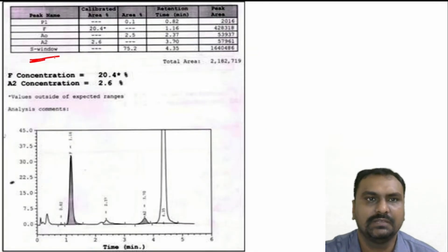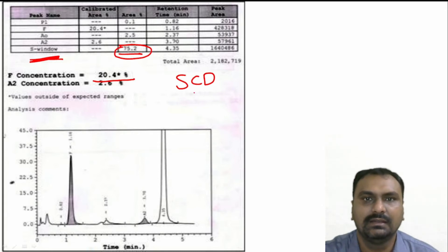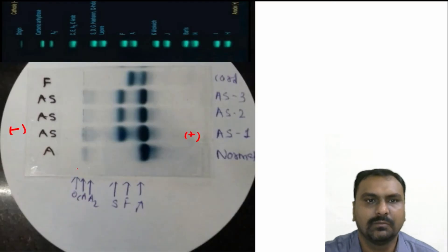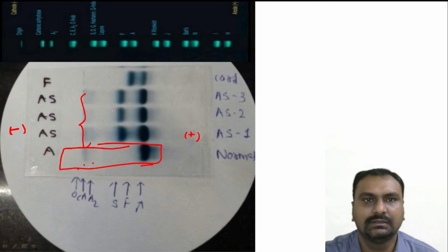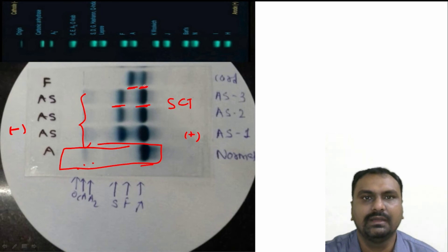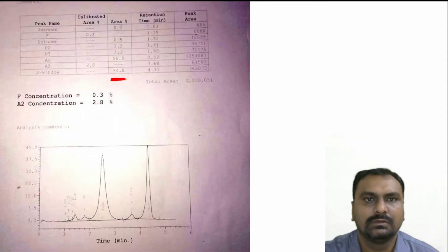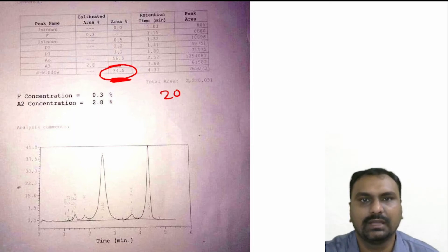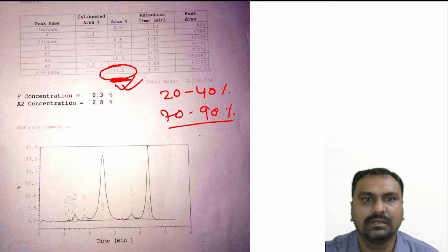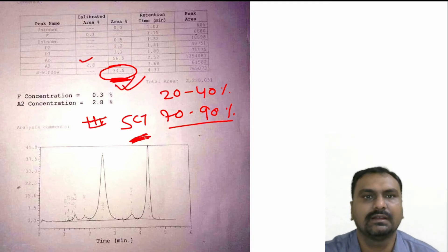This is a photograph of the HPLC. You can appreciate around 75% of HbS and fetal around 20% in case of sickle cell disease. This is the point of application, carbonic anhydrase, A2. This will be the normal patient, while bands at the S region and A region indicate sickle cell trait. In case of a newborn, there is a band at the F and A region, so that will be the newborn or cord blood. On the HPLC report, S percentage is around 34%; for heterozygous the percentage will be around 20–40%, homozygous 70–90%. As it is 34% and there is also HbA, this is sickle cell trait.